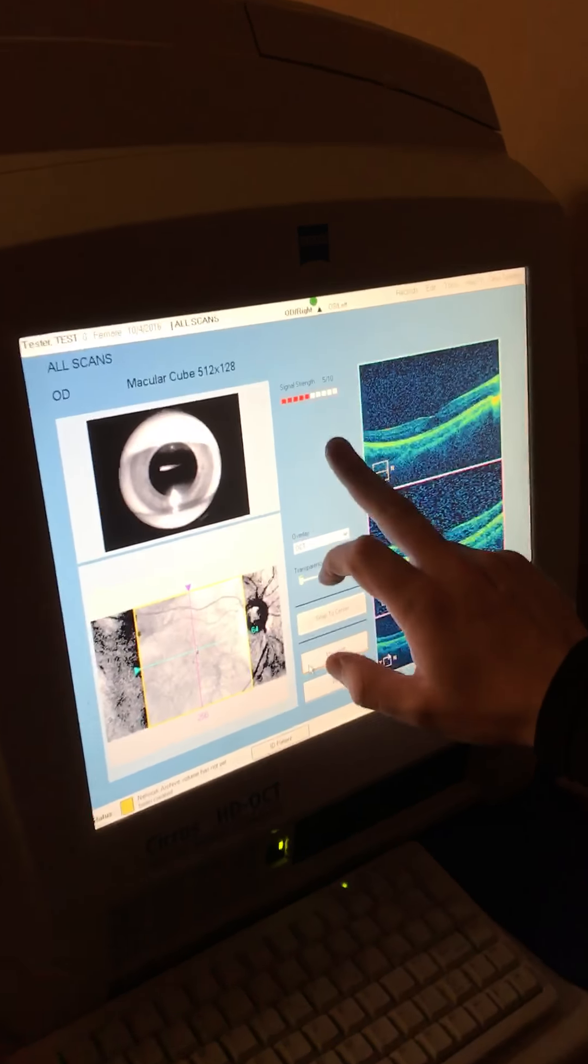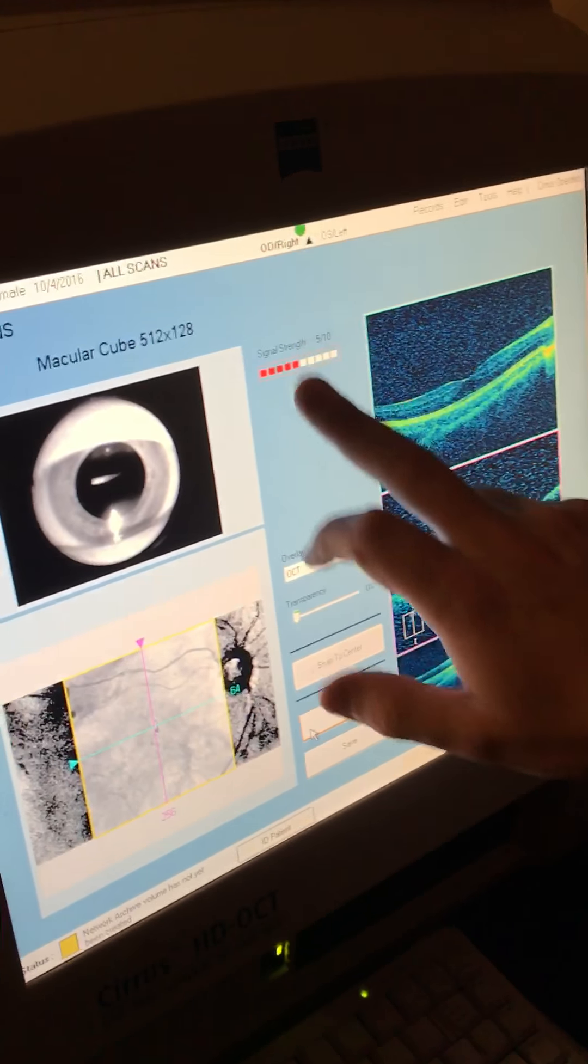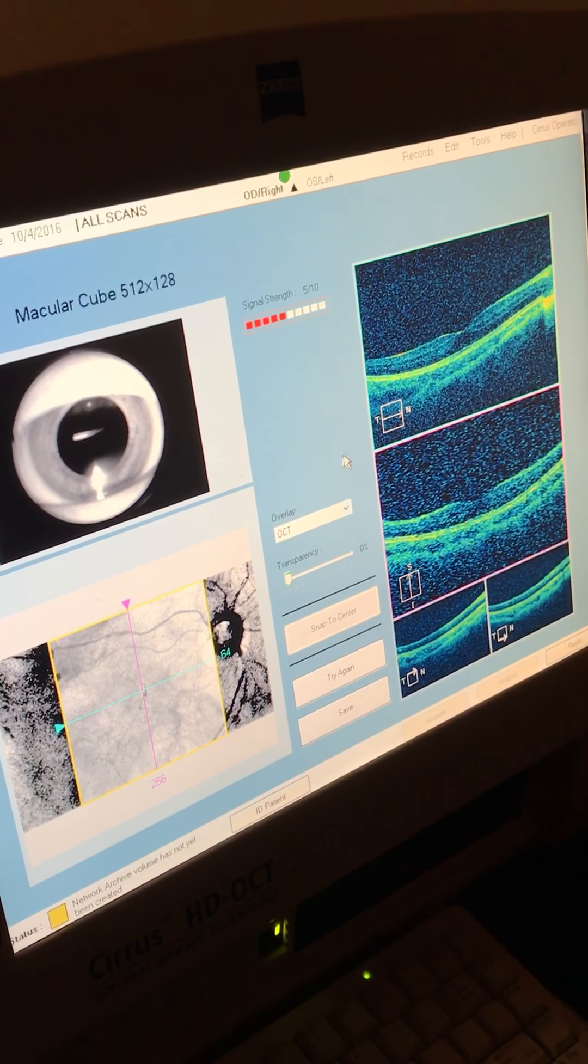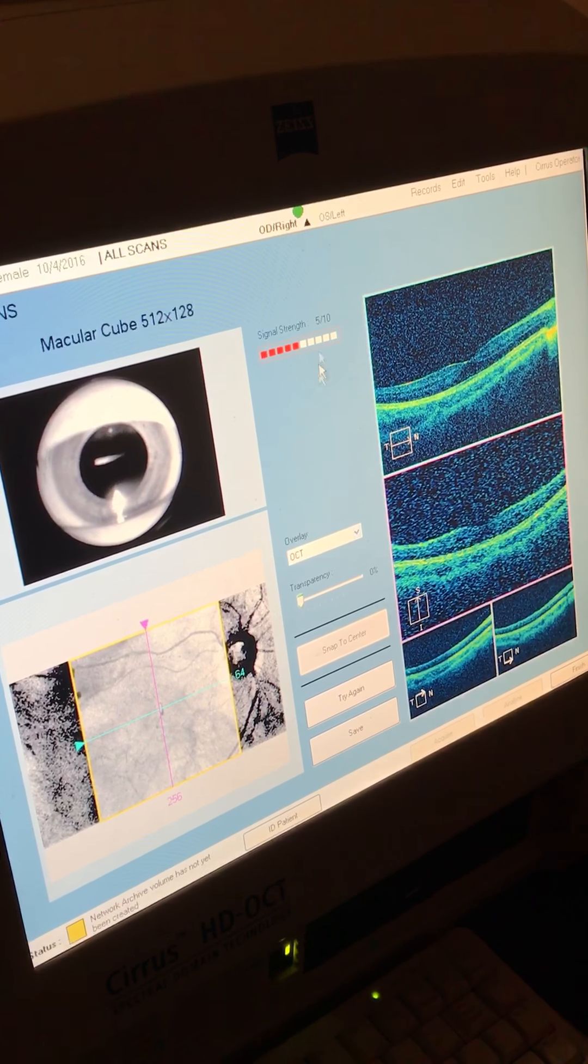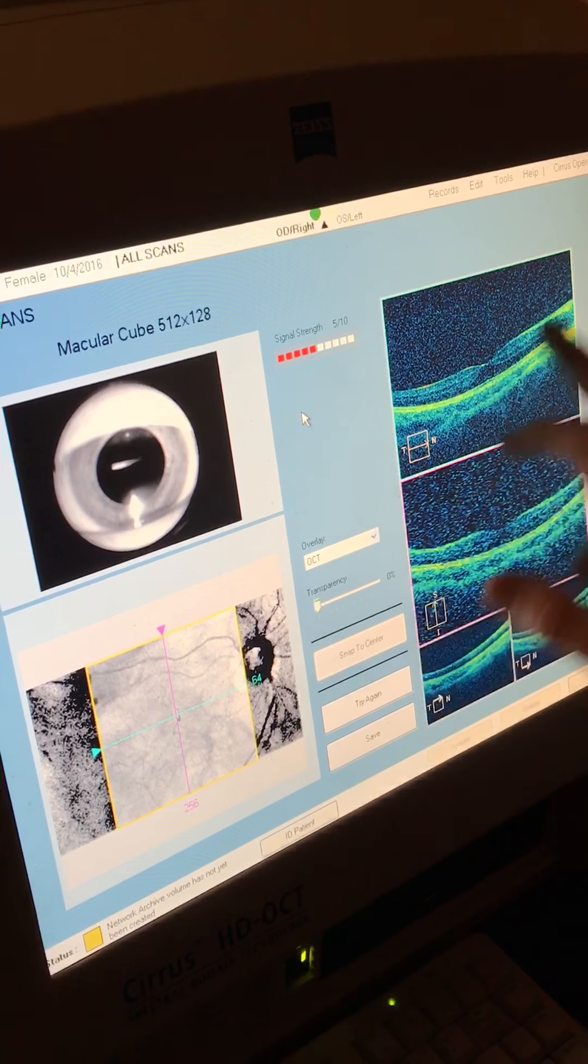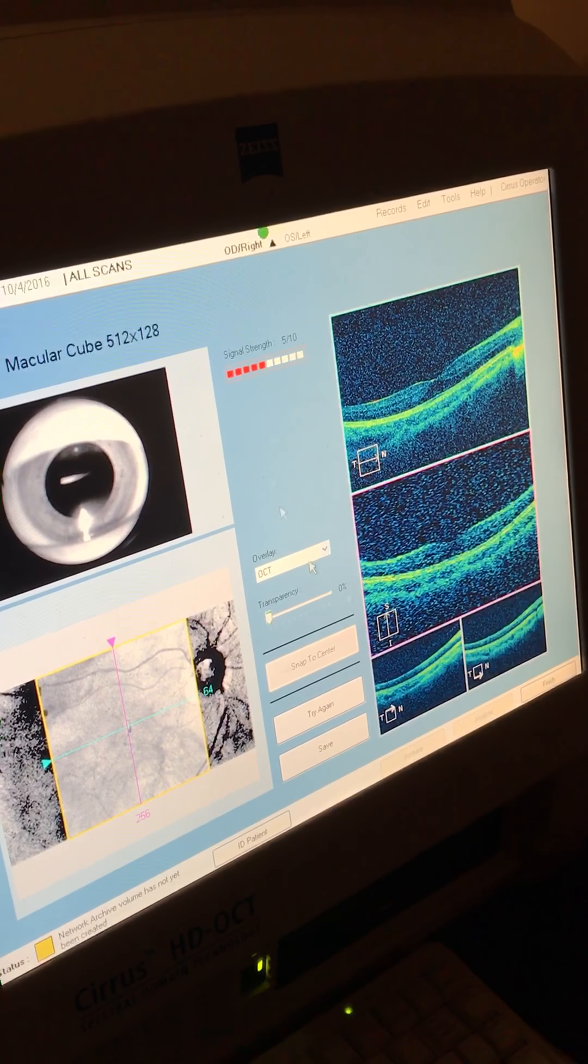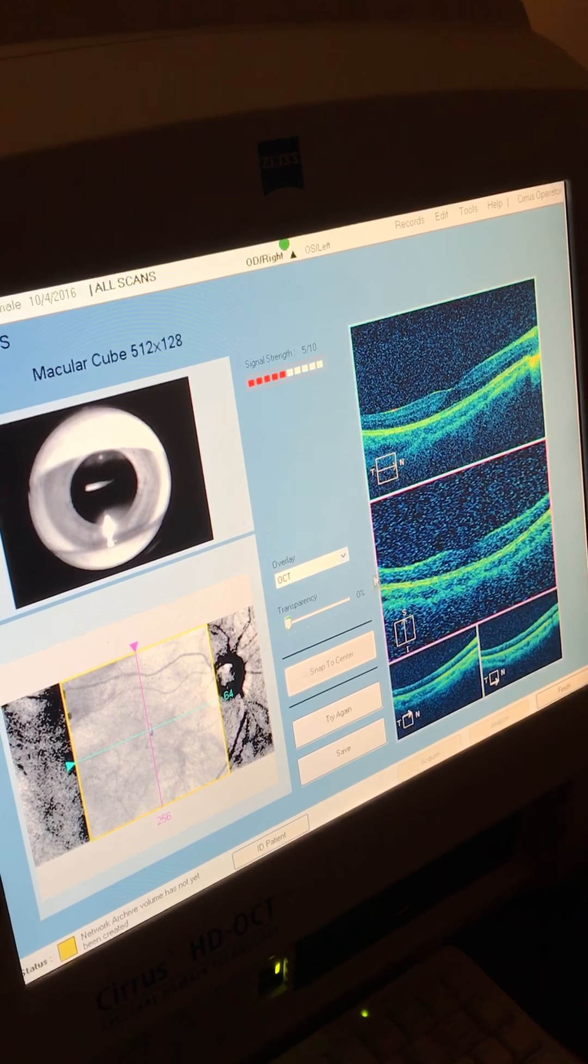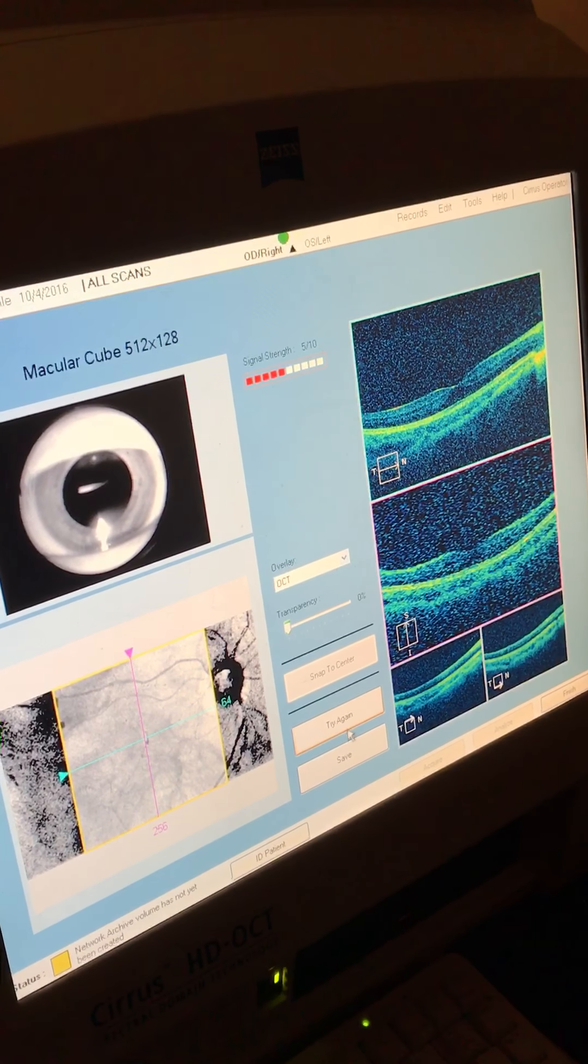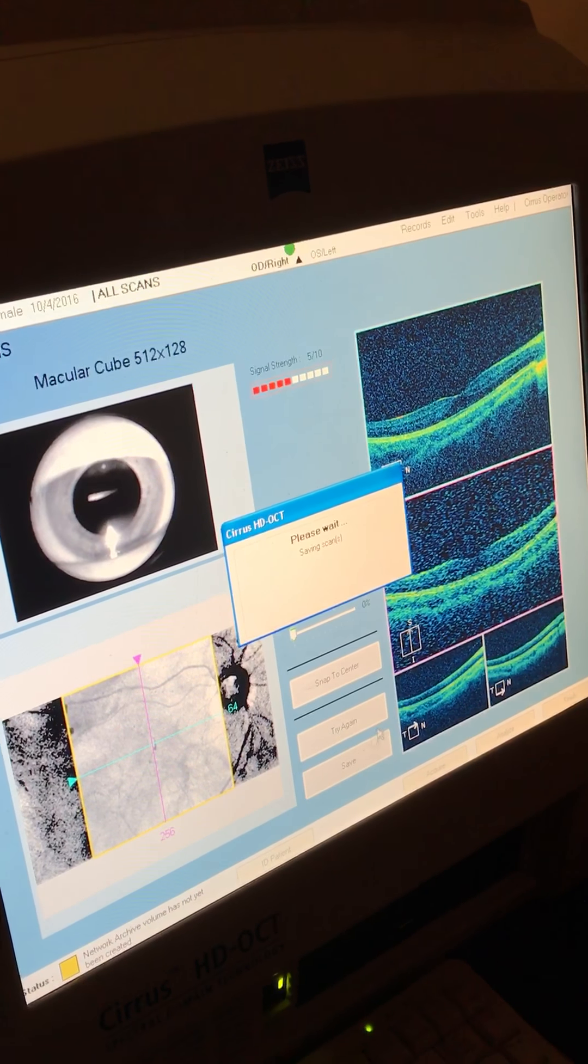So it tells you the strength up here. It should be about six to seven if you can get them. Patients who have cataracts or any other pathology might have a lower signal strength, but as long as the fundus image looks good and you have a good scan in each box, you're pretty good. So we're going to hit save. If it's not good, we'll hit try again. So we'll save this one.